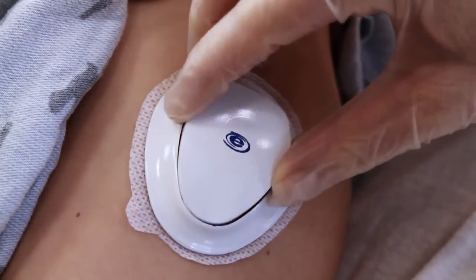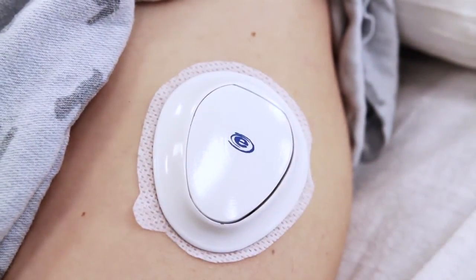Once the skin is prepared, the integrated sensor and wireless transmitter is applied to the site.